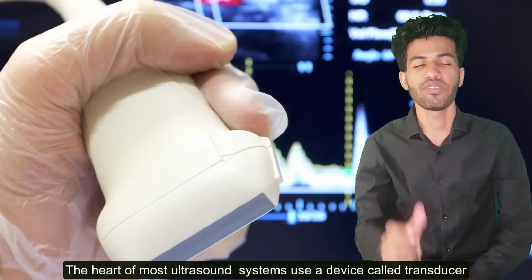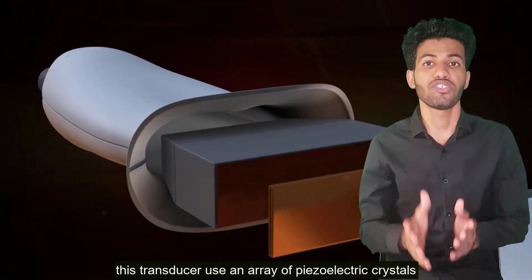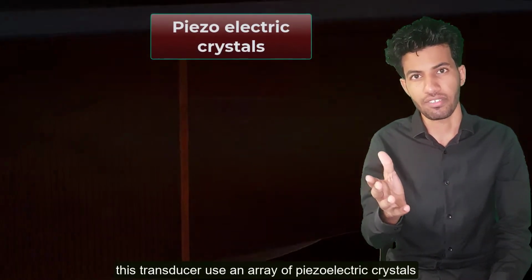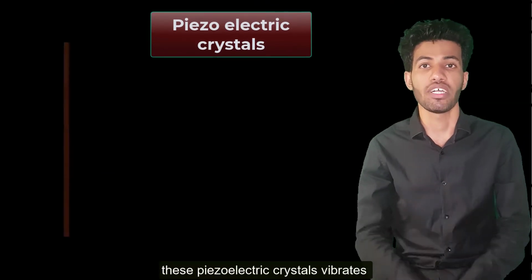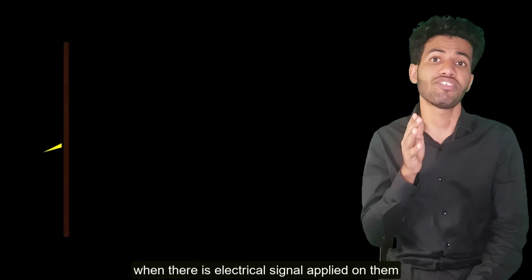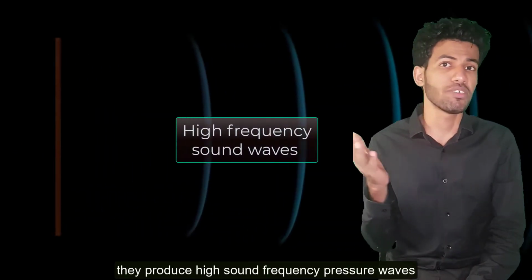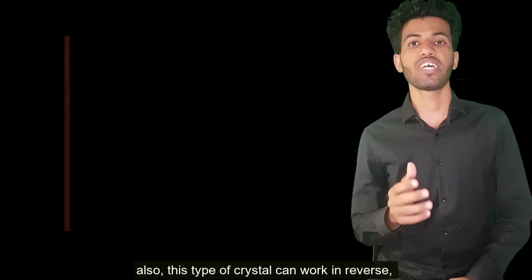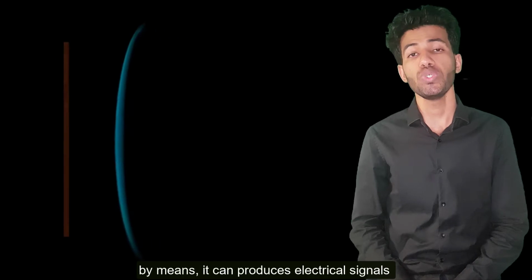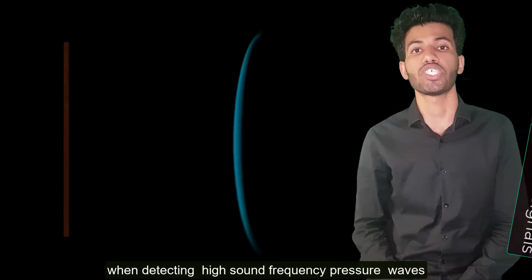The heart of most ultrasound systems is a device called a transducer. This transducer uses an array of piezoelectric crystals. These piezoelectric crystals vibrate when an electric signal is applied to them, producing high-frequency sound pressure waves. Also, this type of crystal can work in reverse, meaning it can produce an electric signal when detecting high-frequency sound pressure waves.